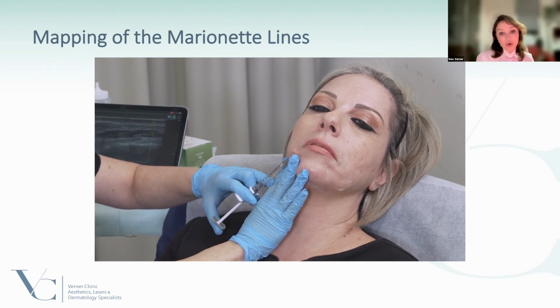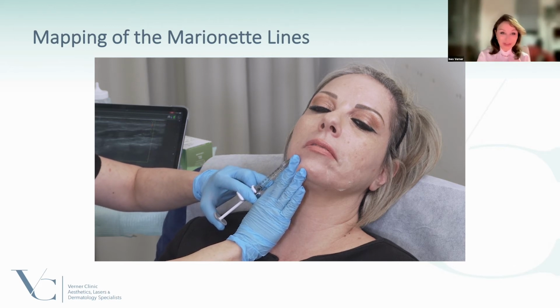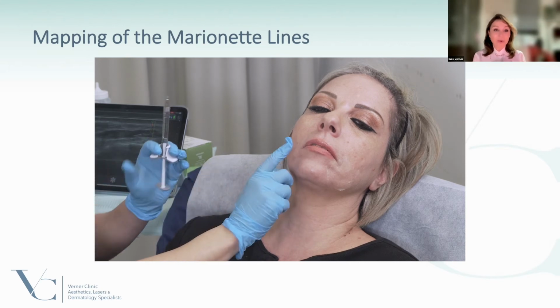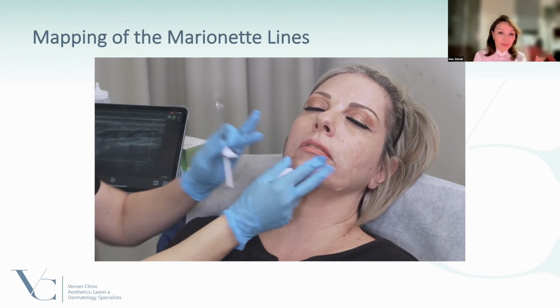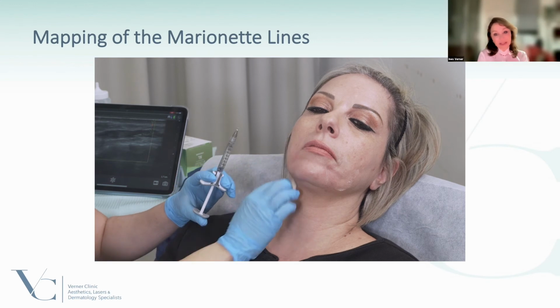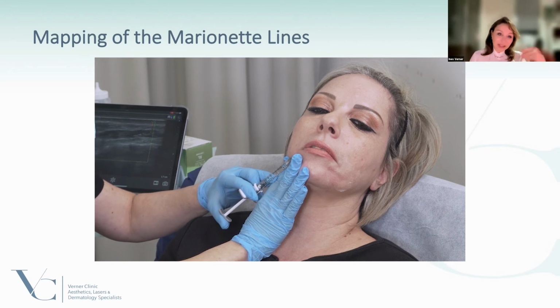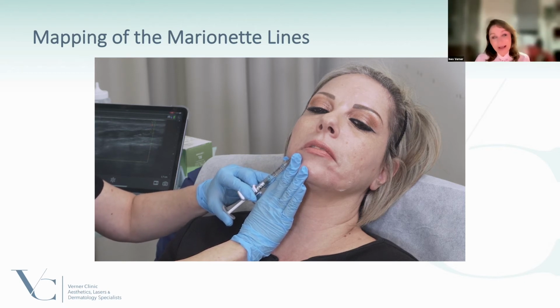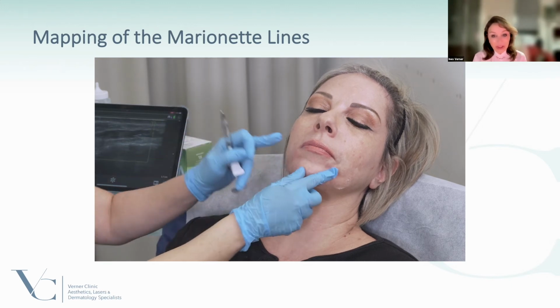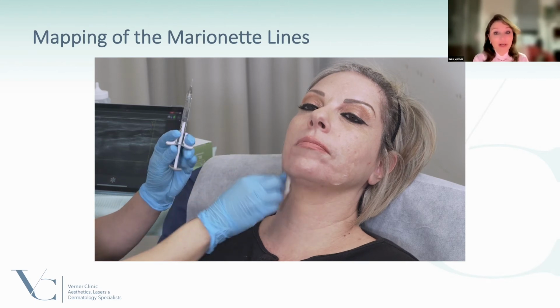And here I'm showing you the injection. What is also very interesting is that when you inject after ultrasound mapping, you have nearly no bruising. It's really nice, because when you move away from the larger vessels, and yes, of course, there are capillaries, you can hit a capillary and not press, and then it will, of course, bleed on. But if you press immediately after the injection and you move away, you can have nearly no bruises. And so it's very, very nice to get patients out of the clinic without bruises.